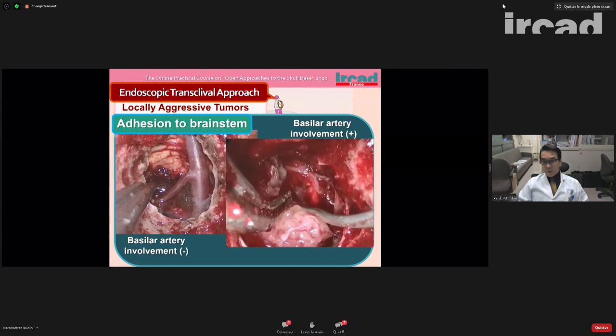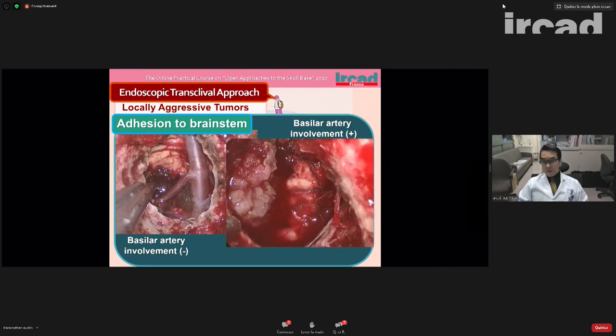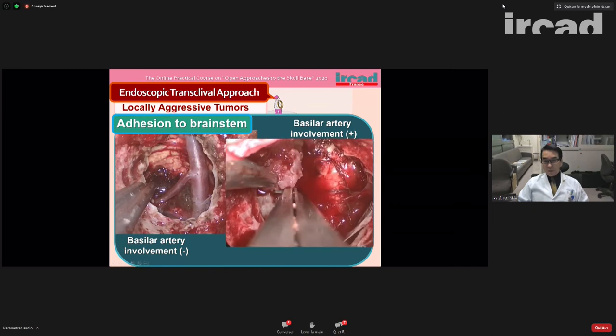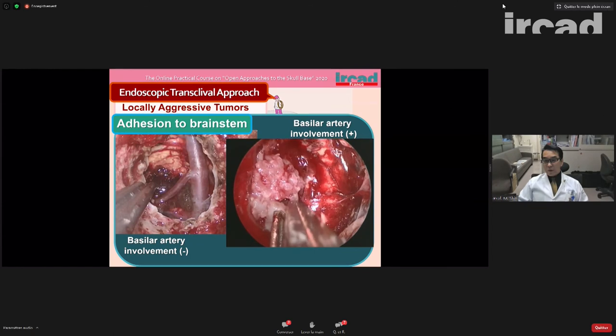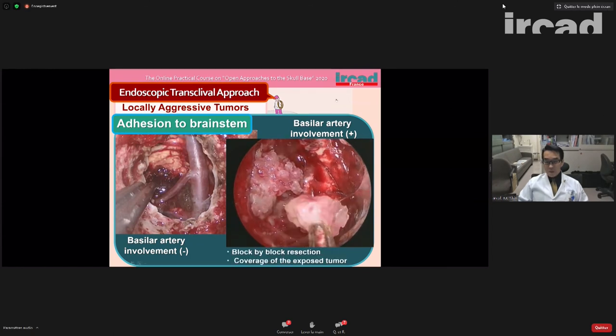And remove the tumor block by block. But in this situation, we have to be very careful not to disseminate the tumor cells. So we recommend the block by block resection.